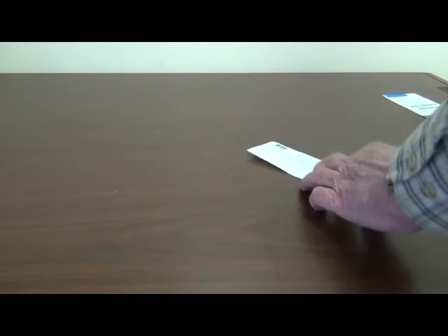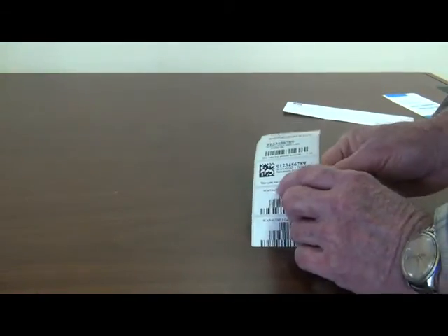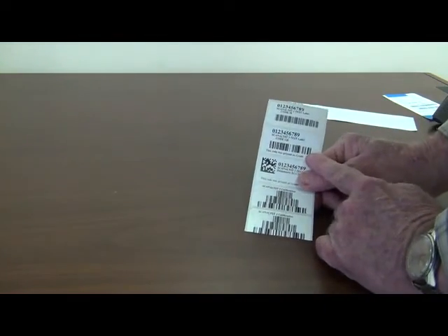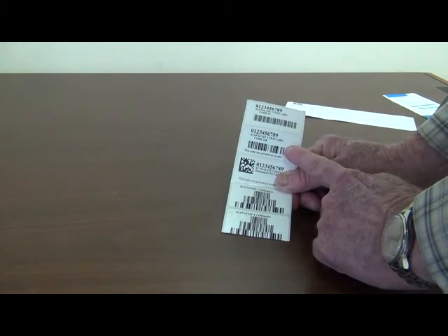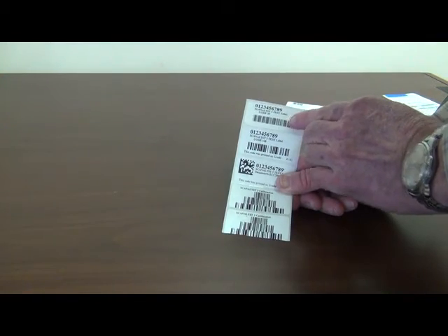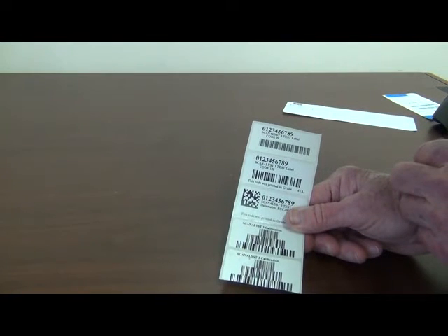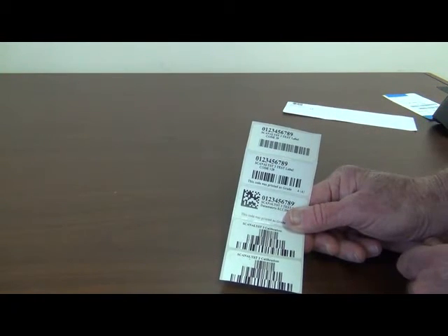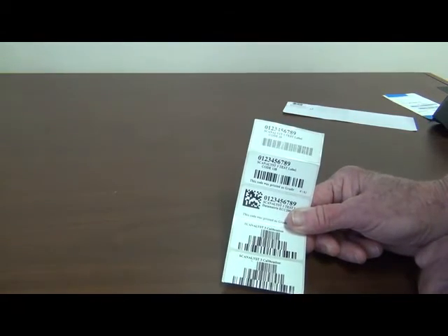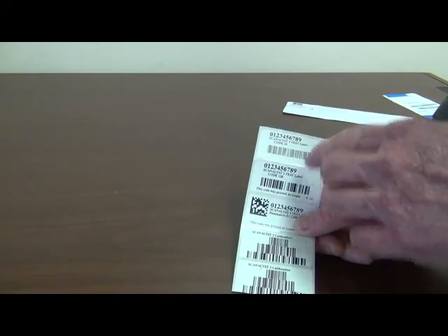Some tips for good barcode practices. First of all, bigger is better in barcodes. When you look at barcodes and you see a large X dimension, that's the narrow bar, and you compare it to another barcode that has very small bars, you'll know that the larger barcode is easier for the scanner to see. So bigger is better.